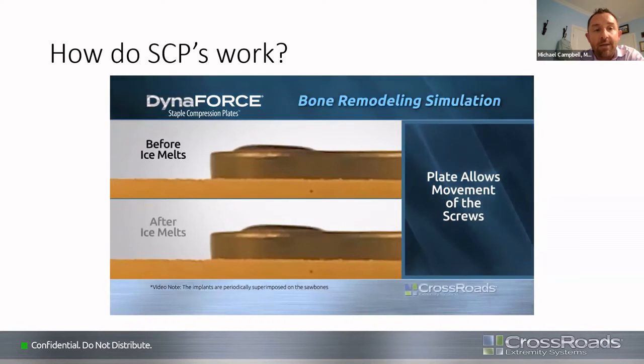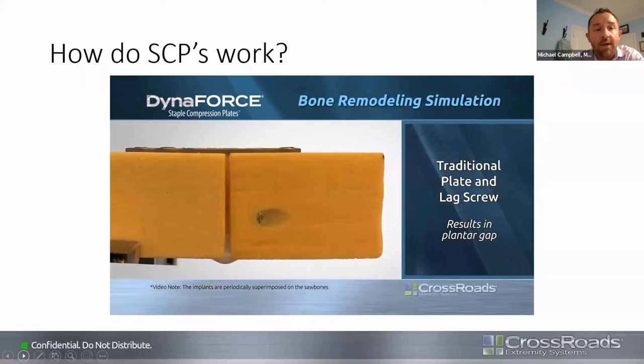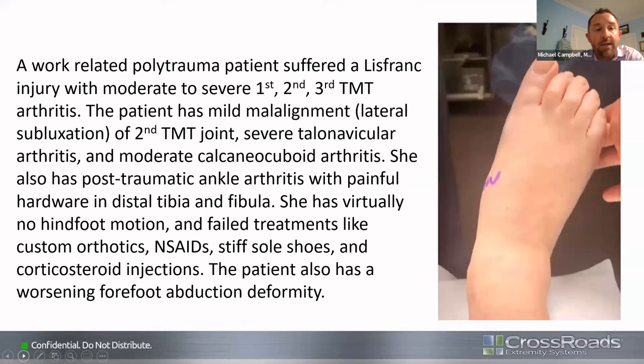I said I was going to show that video at the end. I forgot that they included it here. And actually, you don't just get angular compression. Looking at this and measuring it, you get a little bit of longitudinal compression as well. So it's not just a plantar compression. The whole construct is actually dynamic and moves, and that's really the neat part about this.